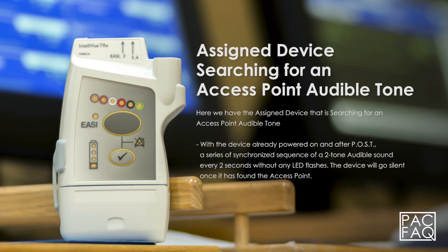Here we have the assigned device that is searching for an access point audible tone. With the device already powered on and after POST, a series of synchronized sequence of a two-tone audible sound every two seconds without any LED flashes. The device will go silent once it has found the access point.